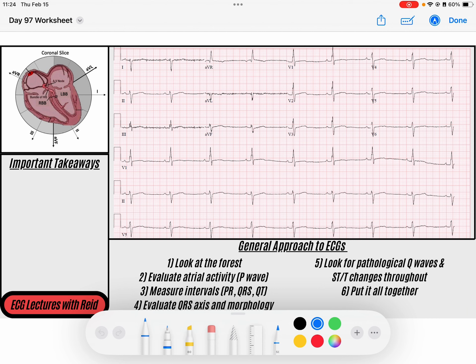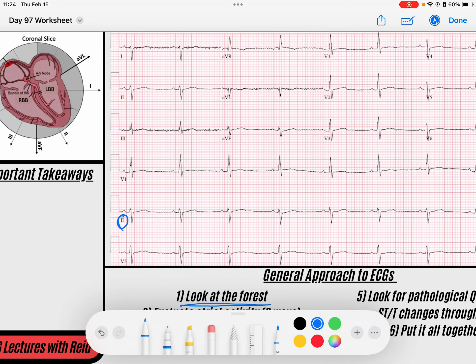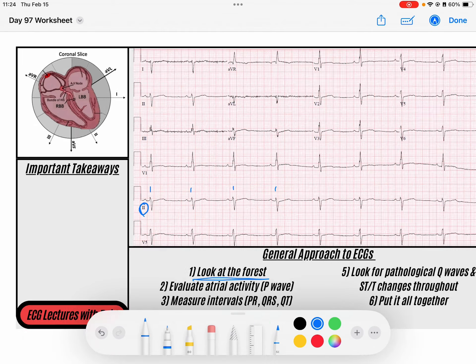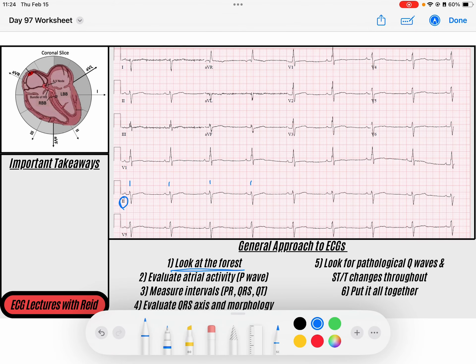Let's jump into this one. The first thing I like to do is look at the forest, get an idea of what's going on, and the trees of the forest are my QRS. Down here in lead 2, I've got what appears to be a narrow complex rhythm that is just beating along at a pretty regular rate and rhythm, and that continues throughout the entirety of the strip.